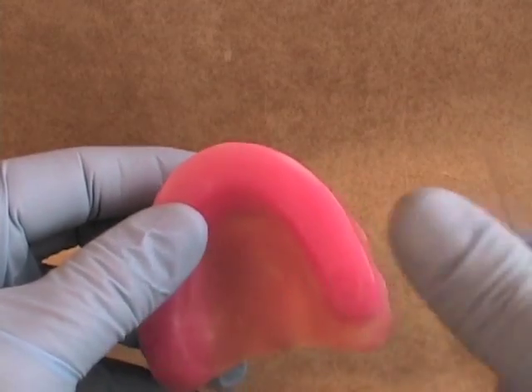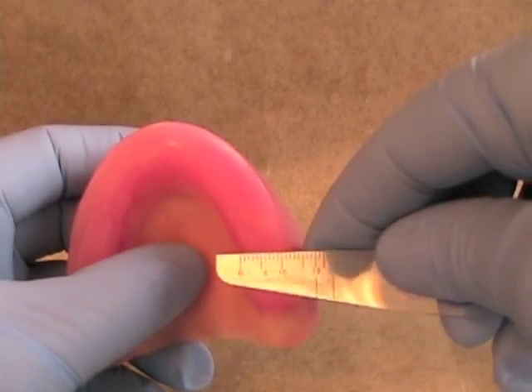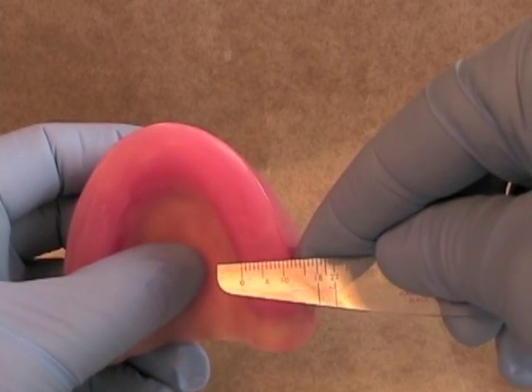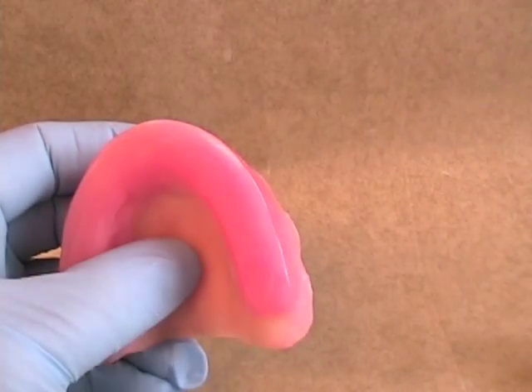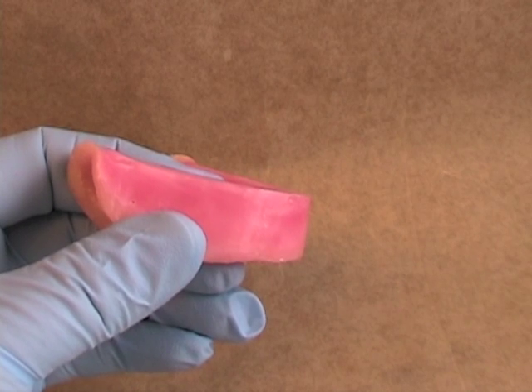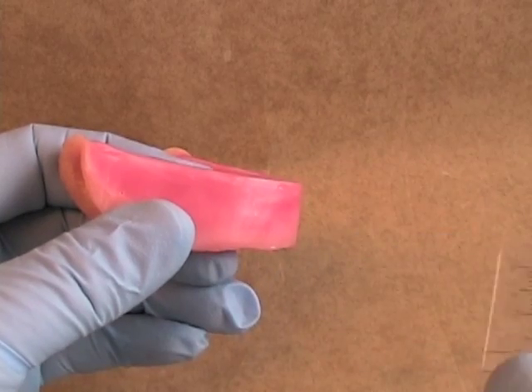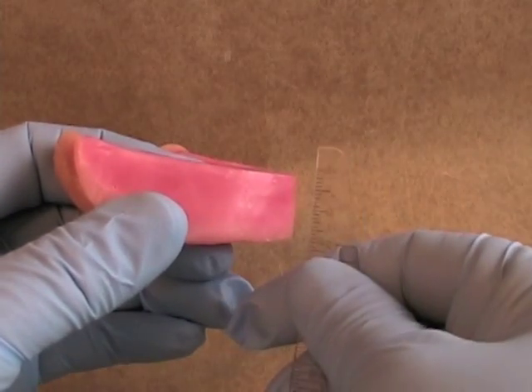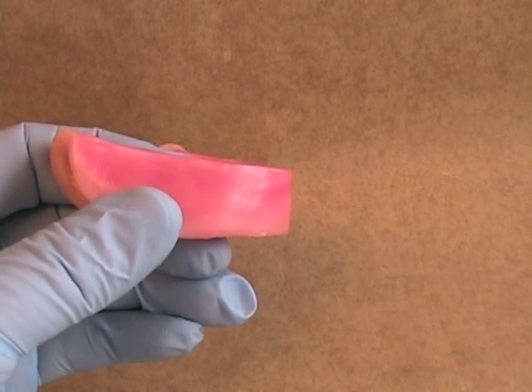You need to tell the patient that the denture teeth will not feel that bulky. In the posterior region, the width of the rim should be approximately 10 millimeters in both the maxilla and the mandible. The mandibular rim should also be slightly proclined in the anterior region, but the height should only need to be about 18 millimeters. Again, that's just a general guideline.